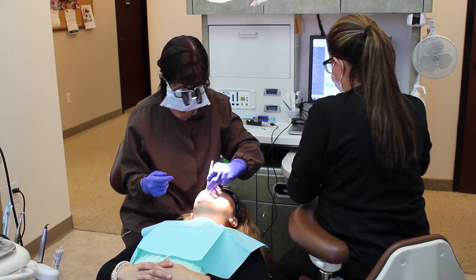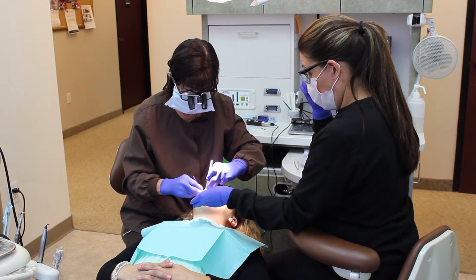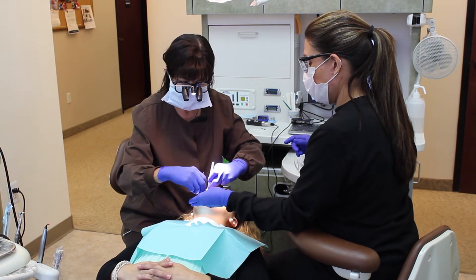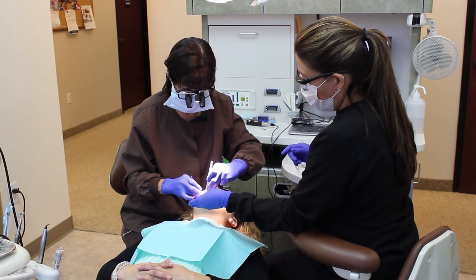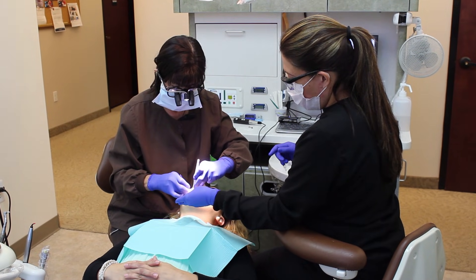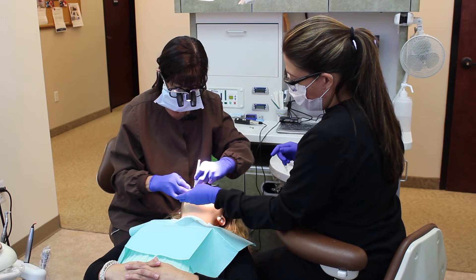We're going to be putting in a bonded filling — it's a tooth-colored filling, we call it a composite. We don't use the metal fillings anymore. Too many bad metals in the silver fillings, and over time they can tend to crack your teeth. So almost all dentists don't do the amalgams anymore.